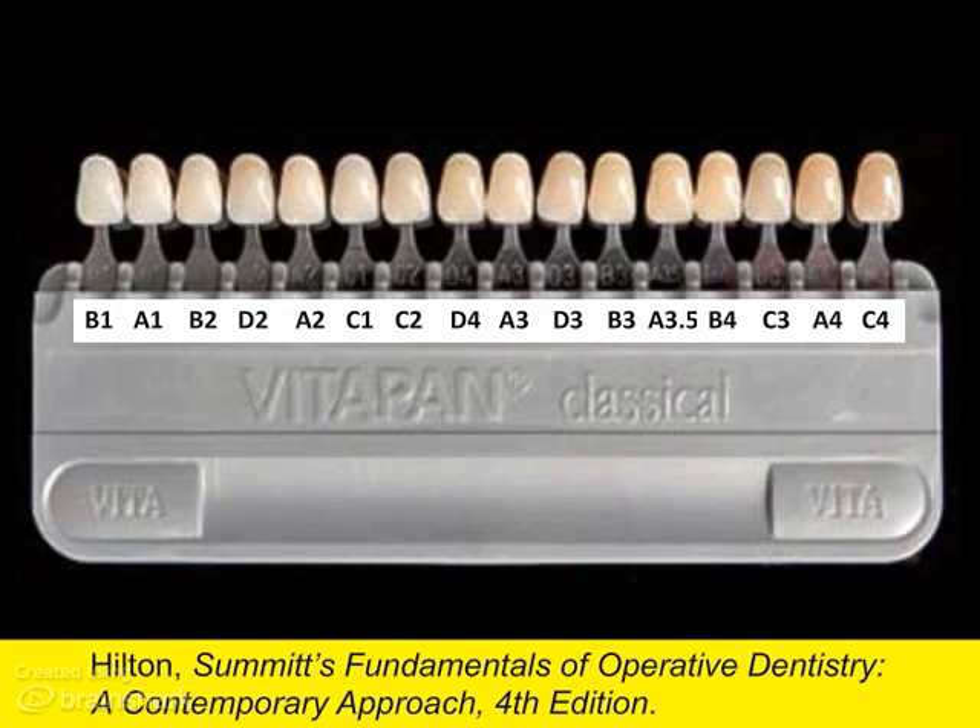The tabs can be reorganized into the value scale arrangement, as you see here. This displays the tabs from lightest, B1, to darkest, C4.